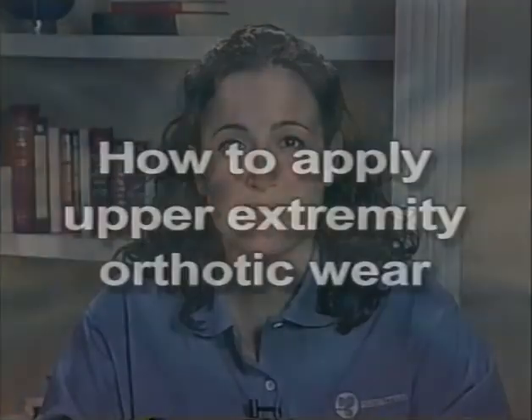One of the ways to help this is through the use of orthotics. Orthotics are based on the principle that if you hold a muscle in a prolonged stretch, you will retrain or quiet the nervous system. This in turn prevents the formation of contractures and allows us to either maintain or gain range of motion.